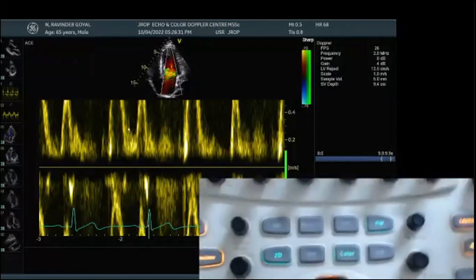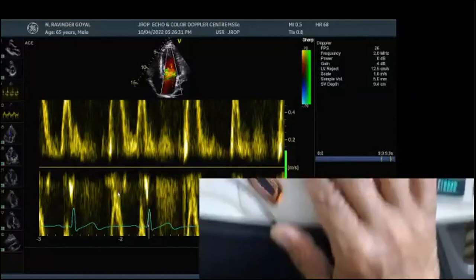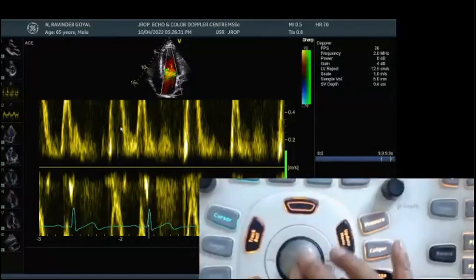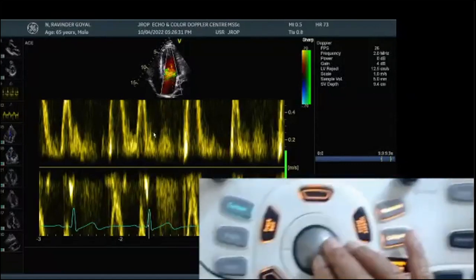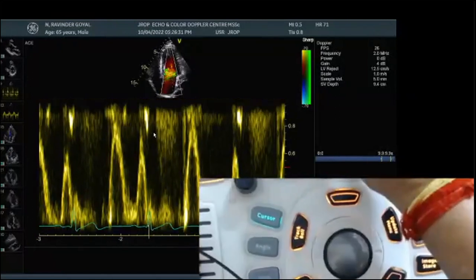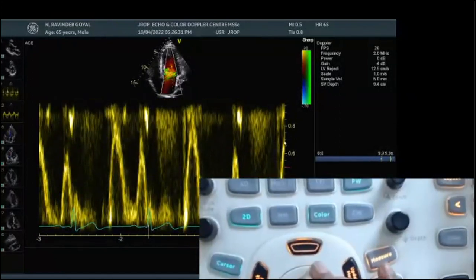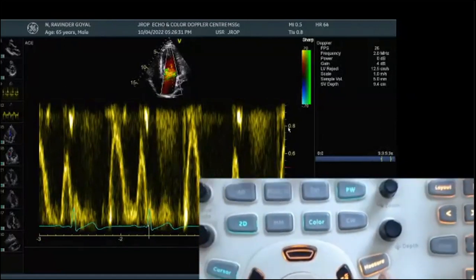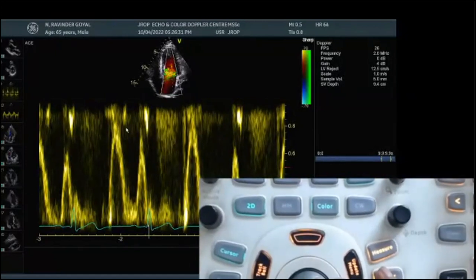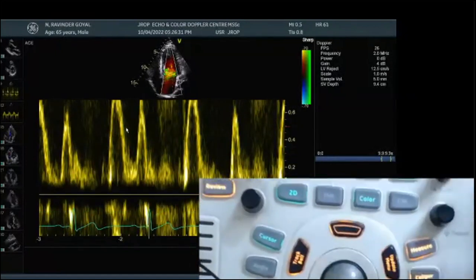The Doppler flow pattern is cut off on the top for a mitral flow pattern, and this is seen on the bottom of the screen. This is what is known as aliasing. How to improve this aliasing is, we bring the baseline down. With bringing the baseline down, the scale has gone to 0.2 to 1 meters per second, and we are able to see this Doppler spectrum pattern. Suppose we cannot do that, what should we do next?